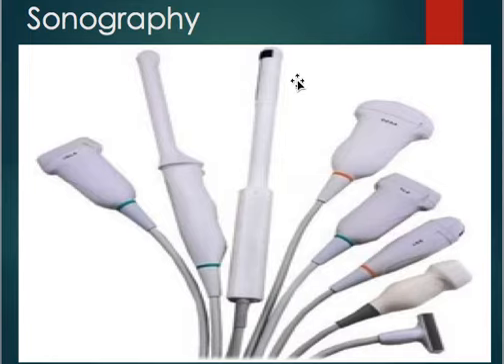The acoustic lens on the transducers helps focus these emitted sound waves, so it's directing them into the body instead of kind of bouncing off. So when the transducer is placed against the skin, the sound waves come out and it hears its own echo, that reflected sound that's coming back. It produces the white image. So if the transducer doesn't hear any sound, then it's black.